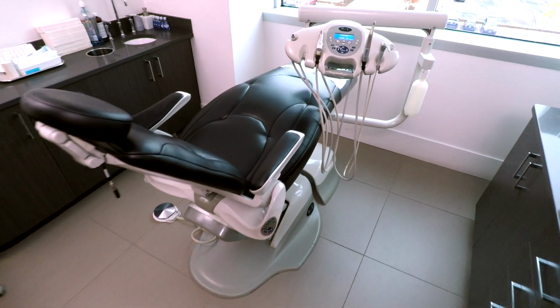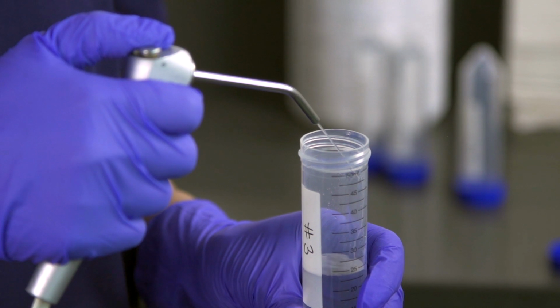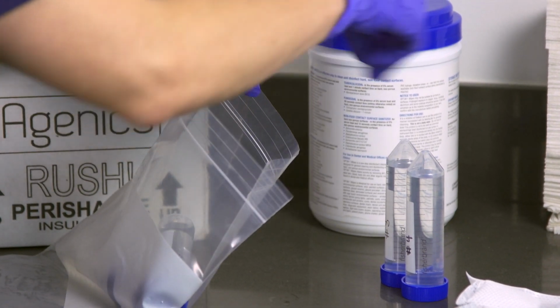But just how big is the problem? And just what can be done to protect your practice and, most importantly, your patients? In this video, we'll talk about the problem of bacteria in dental water lines, how to comprehensively test for bacteria, and how dentists can continuously monitor dental water lines and remain compliant.